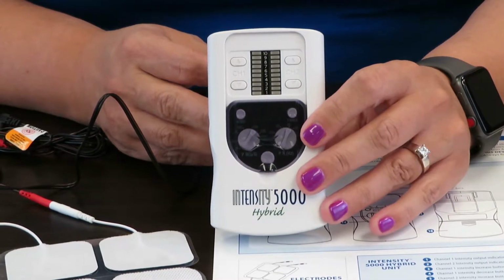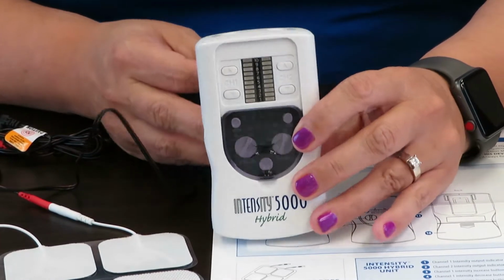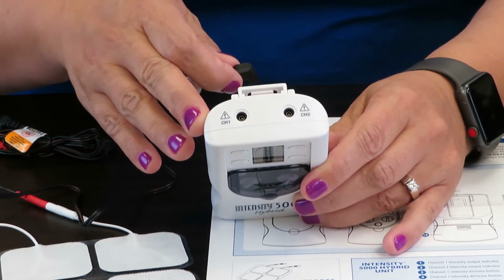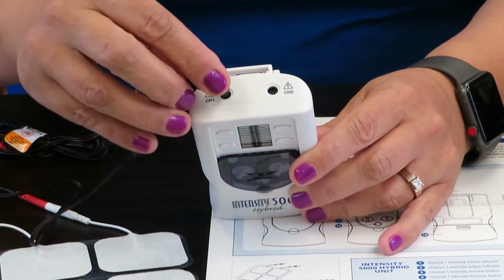Now we're going to connect the lead wires to the device. Make sure the device is powered off. This device has 2 channels, 2 electrode pads for each channel. You may choose to use one channel, or you can stimulate 2 areas with both channels.